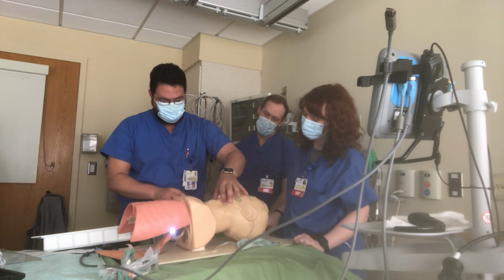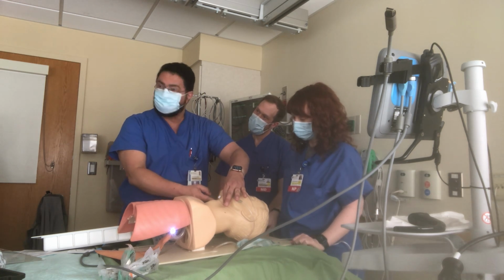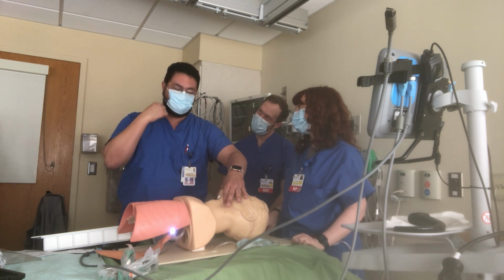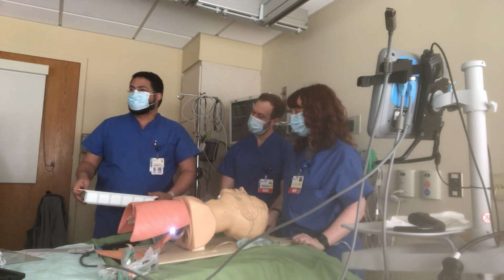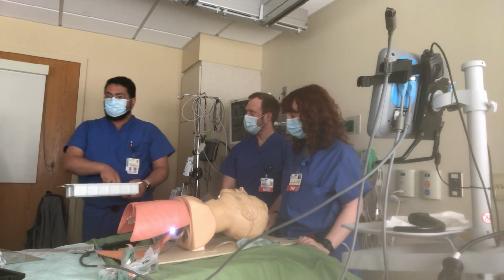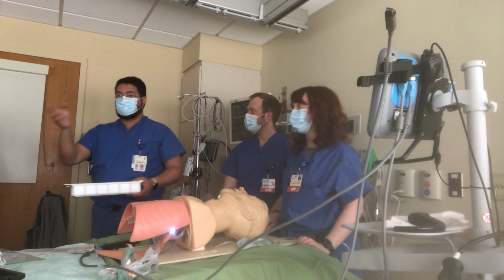I just hold the hyoid bone, push it from one side, inject on this side, hit the hyoid bone on the other side of the hyoid, and inject here. I numb the superior laryngeal and do the same from the other side. This is bloody horrible. It takes just 2 minutes, but it doesn't work half the time. You got it? So right now she has it in her app, and you guys are welcome to get the app too, by the way.